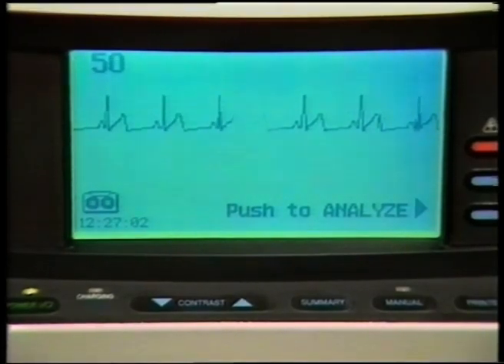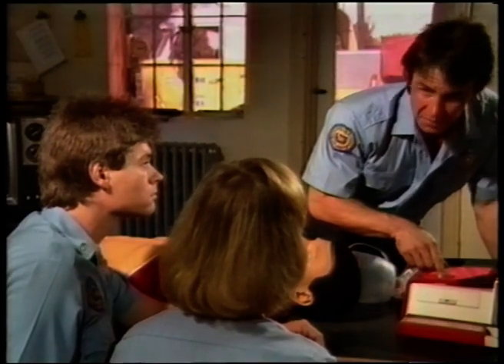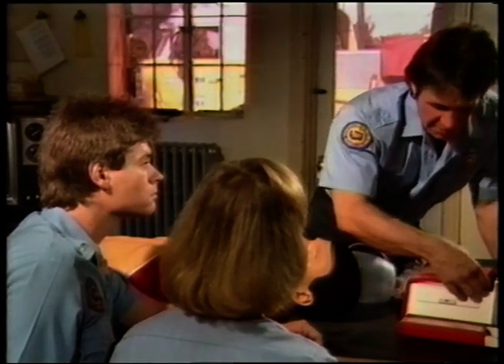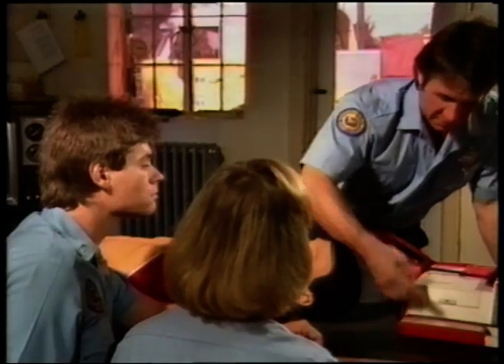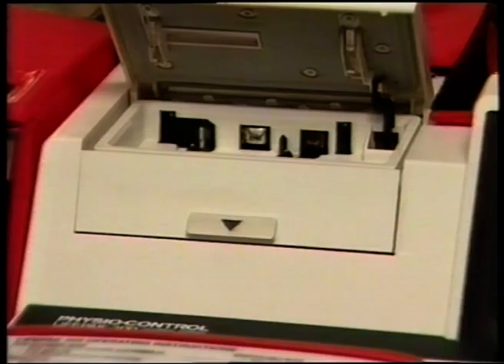If you see the check tape display message, examine the tape through the tape door viewing window. If the tape is missing, jammed, or fully recorded, open the tape door by pushing the front release lever. To remove the tape, grasp the right side where there is an access well and lift it up and out.